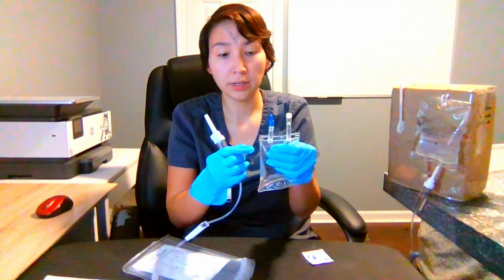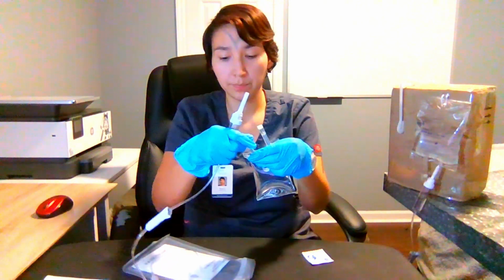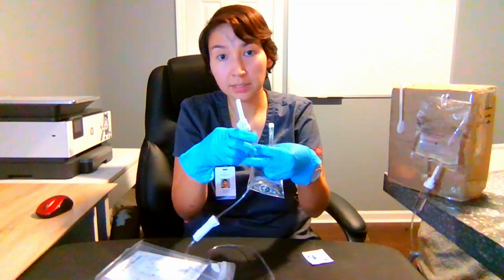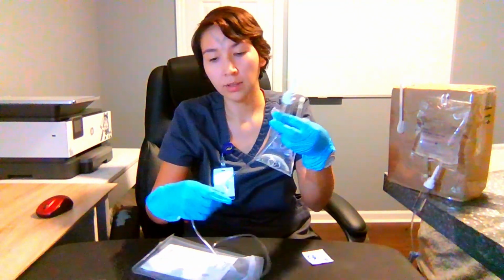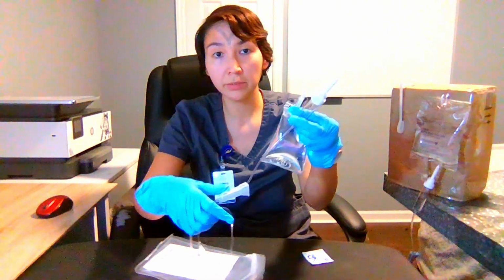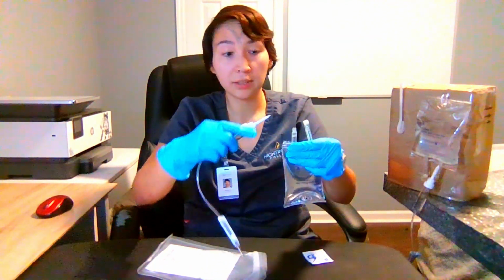I'll remove the medication fluid port bag cap and the spike end cap. Again, ensuring that the roller clamp is completely closed to prevent any fluid flow, and insert the spike end all the way in the port.